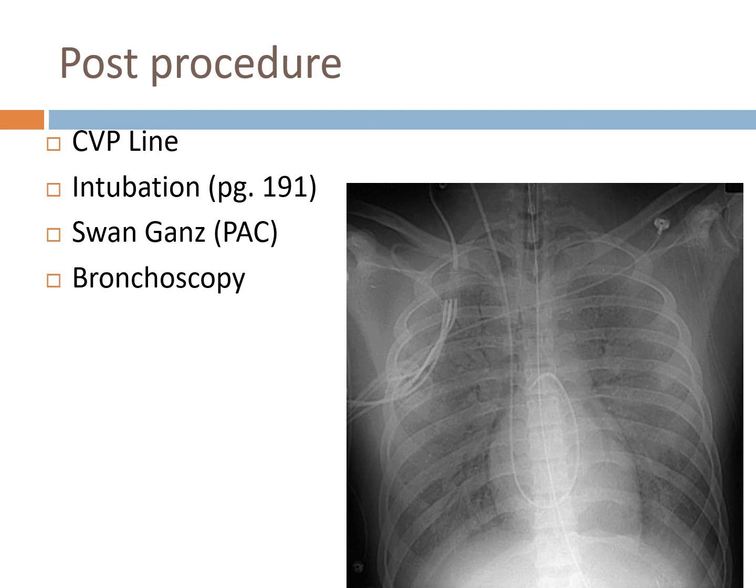I would highly suggest that you read chapter 10 in Wilkins. Read your book. So a CVP is generally placed in the right or the left subclavian or the jugular vein, and it rests right above the superior vena cava, and it settles into the right atrium. So we want to make sure that we haven't given a pneumo, and that the CVP is indeed in the right place. So that's a reason why you would do a chest X-ray.